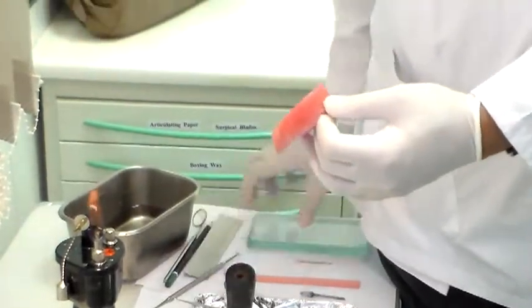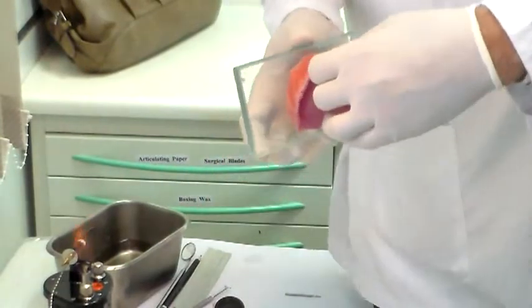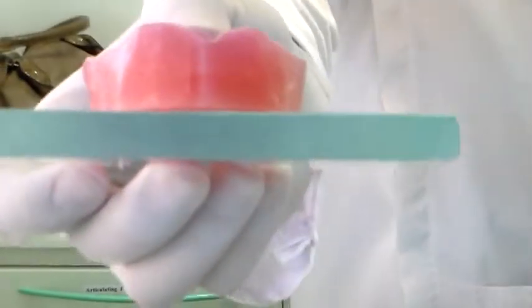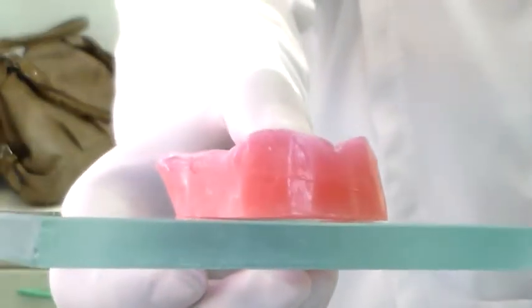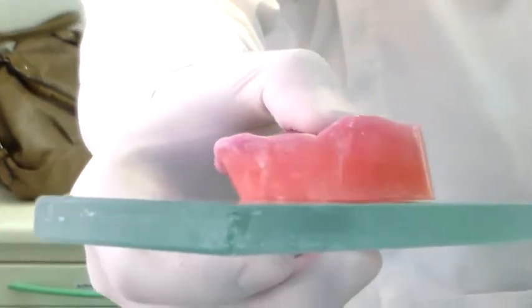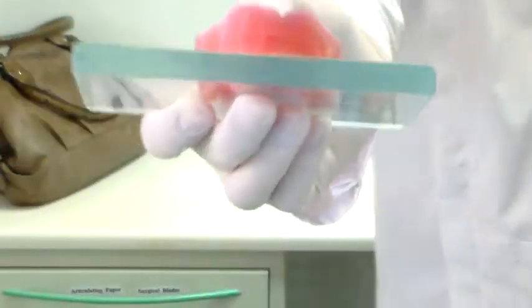You want to check if your surface is flat on a glass plate. Take it with a little bit of pressure and you can check if it is flat. It's important that it is flat every time, so you must check it with a glass plate.